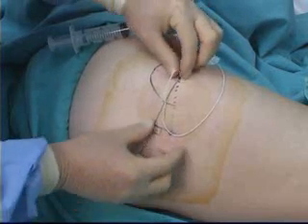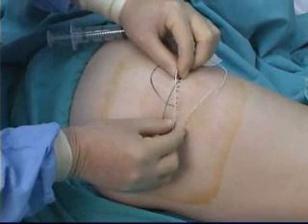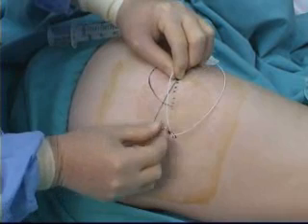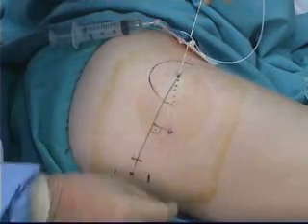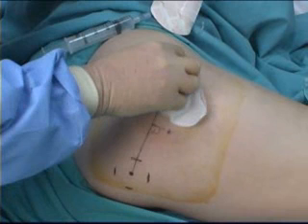If the small silicone tubing is lost or not handy, the catheter itself can be used to protect the skin under the skin bridge, as in this demonstration. Catheter removal is a sterile procedure and is done after the patient does not require the continuous nerve block any longer and after full sensation has returned to the leg. The proximal end of the catheter is fixated with the left hand, and the distal end of the catheter from the skin bridge is removed. This part of the catheter is kept sterile, and the rest of the catheter is removed.